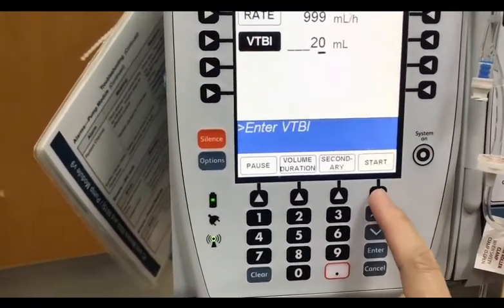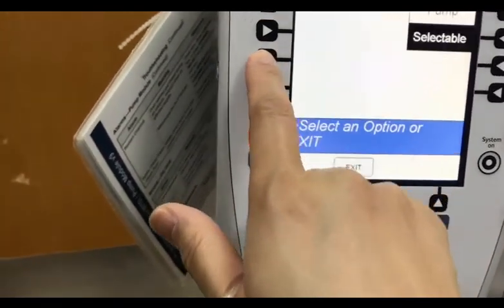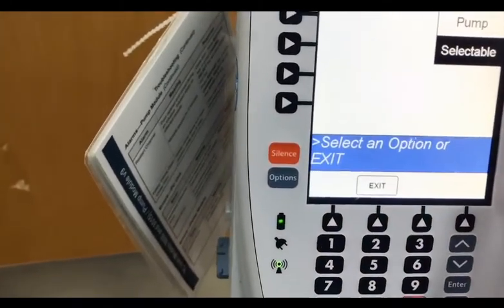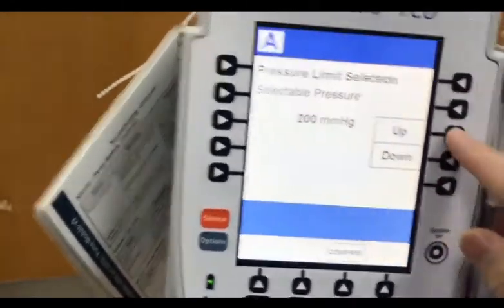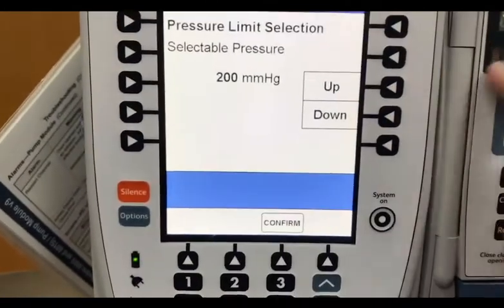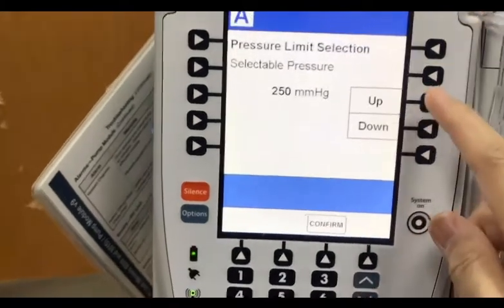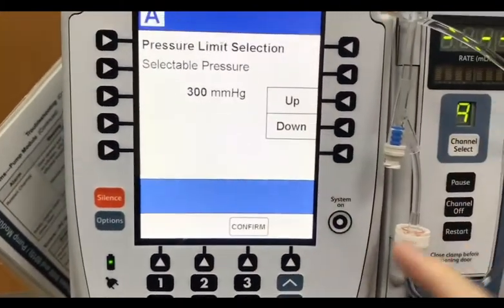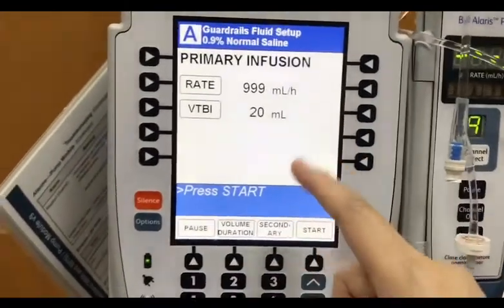But before you press the start, go to the options first. And if for adult, we just go to the selectable, and instead of 200, bring it up, set up to 300, so that the machine will not alarm. So just press confirm, and now we are ready. For example, I'm going to infuse the 20 ml to the patient.